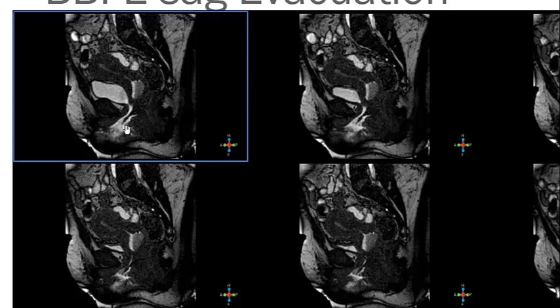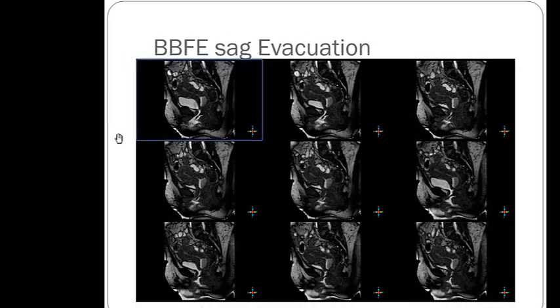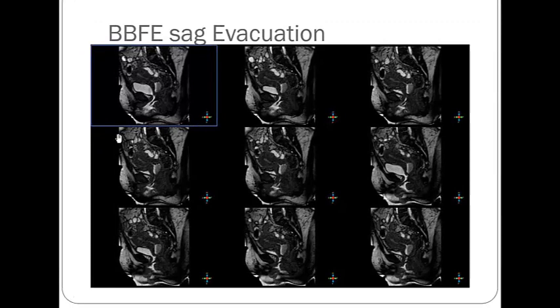We inject gel inside. And this is the confluence of the urogenital sinus syndrome. This is the opening of the cervix in the urethra. So this is an upper confluence. We have upper confluence and lower confluence. It is here opening near the upper end of the urethra, not near the lower end. And the patient was living well, and there is no problem. She gets her menses from the urethra, but there is no infection because I think it's below the bladder neck. So this is a case of urogenital sinus syndrome. We had it before.